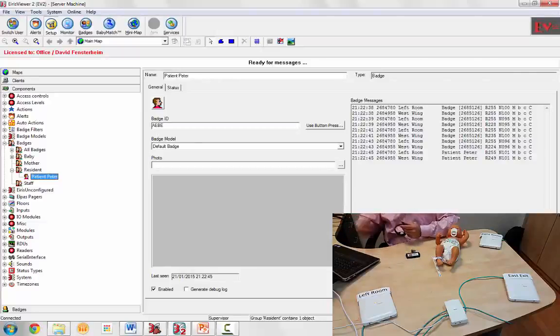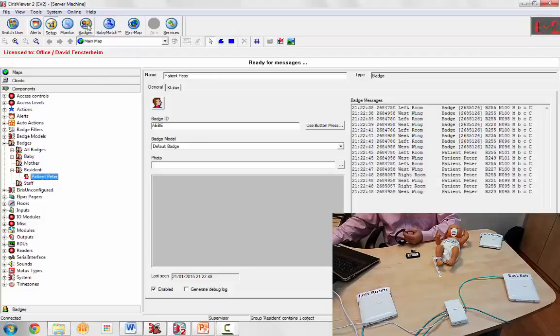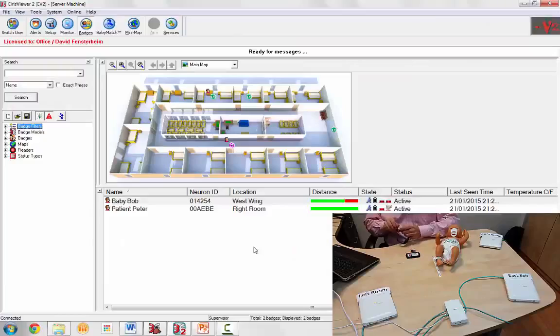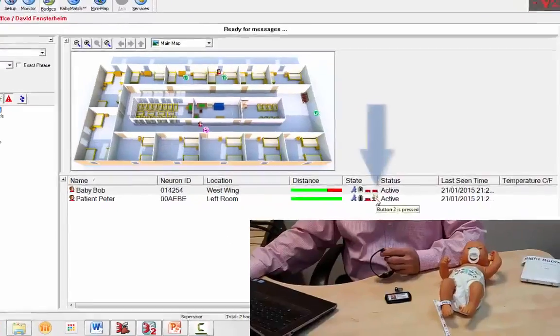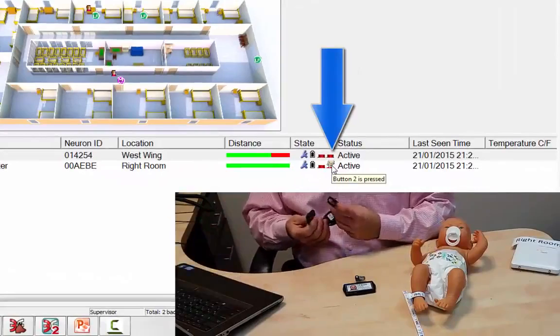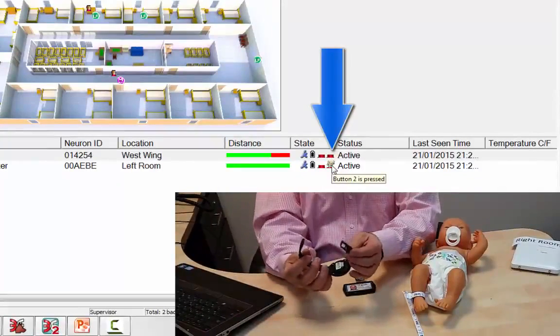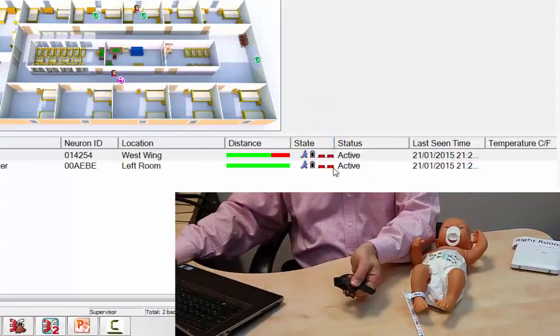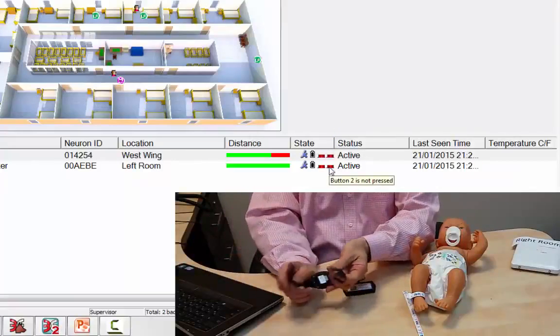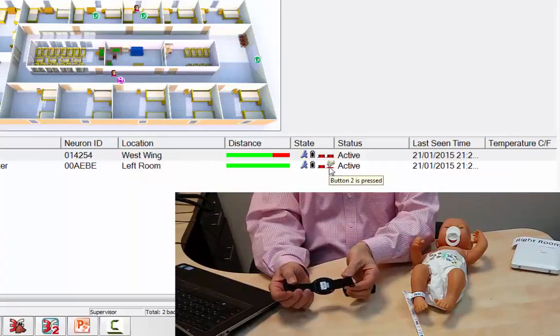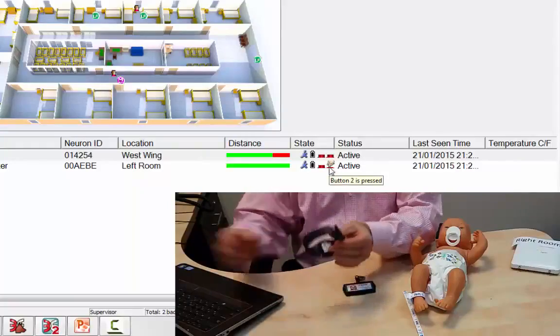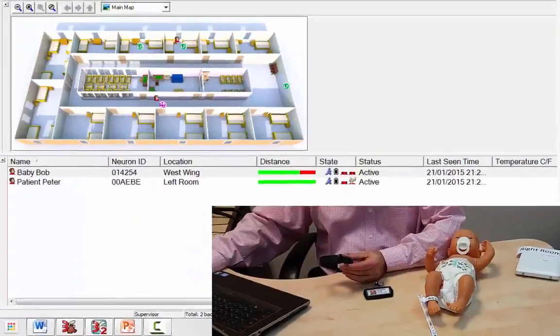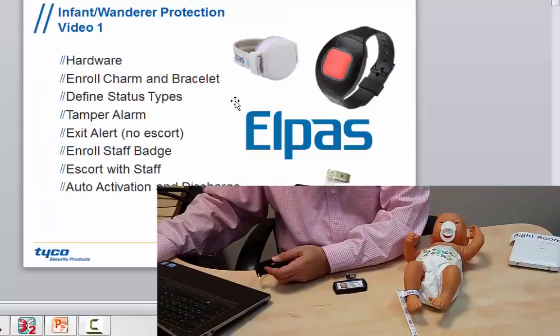You'll see that if we go to the badges screen, that the button 2 is showing as it's tampered now. So the button 2 is pressed because the band is open. We seal the band, the button 2 goes up, and we open up, we get the alarm. Oops, I already defined that alarm. We've enrolled our tags.